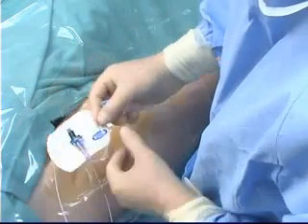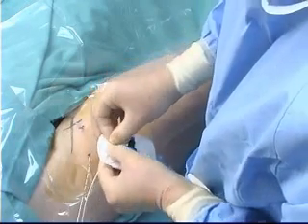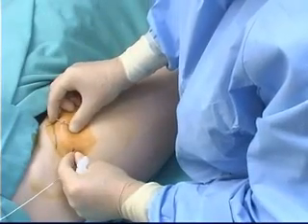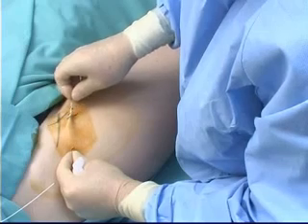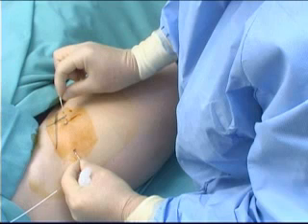The catheter and snap lock is placed in the stab lock, which is placed in a convenient position, usually on the patient's abdomen. Catheter removal is a sterile procedure and is done after the patient does not require the continuous nerve block any longer and after full sensation has returned to the leg. The proximal end of the catheter is fixated with the left hand, and the distal end is removed from the skin bridge. This part of the catheter is kept sterile, and the rest of the catheter is removed.